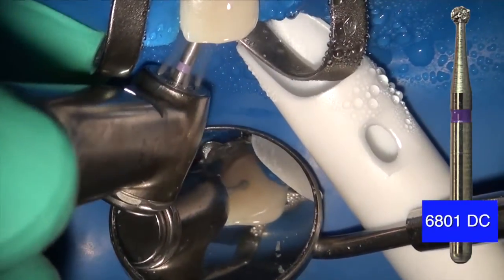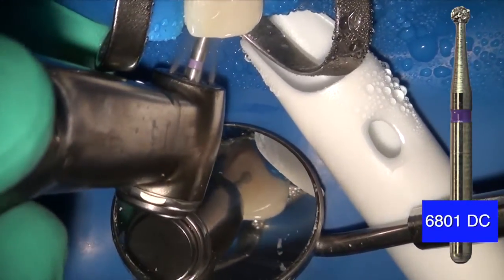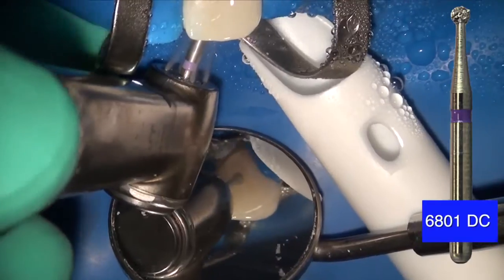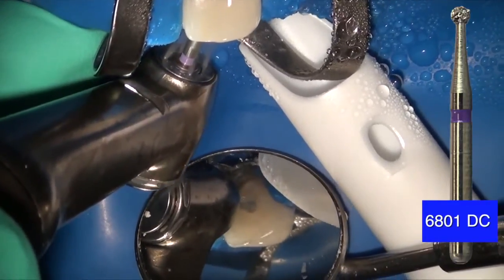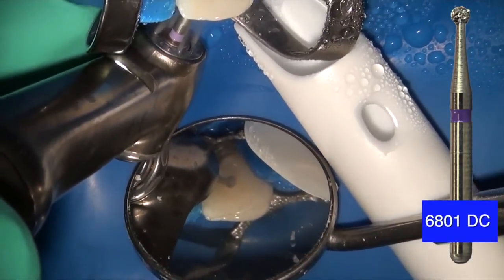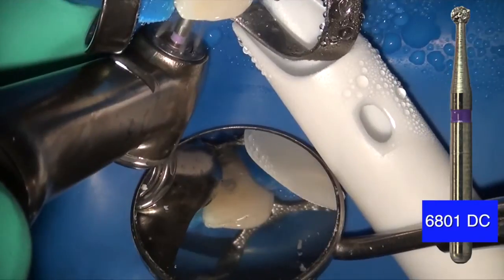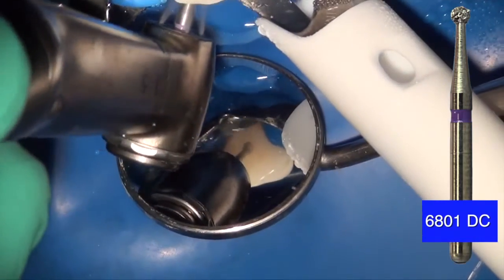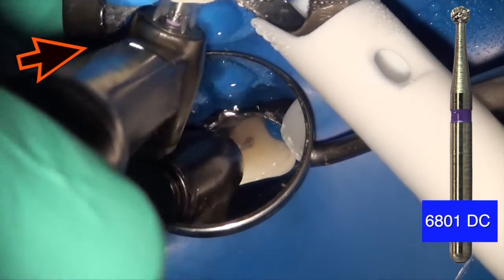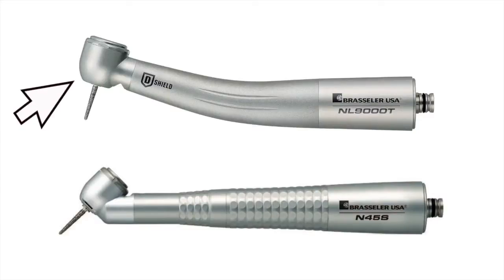This Brassler 6801 DuraCut burr, as well as some of the brazed diamonds, are really ideal for this particular situation. I'm using this at real time to demonstrate how long it takes to access. You have to use very light brushing action and gently remove the material in a very light motion with lots and lots of water. As you can see, I'm using Brassler's Forza electric handpiece, which has lots of torque — but the tip of my handpiece starts to interfere with the clamp.